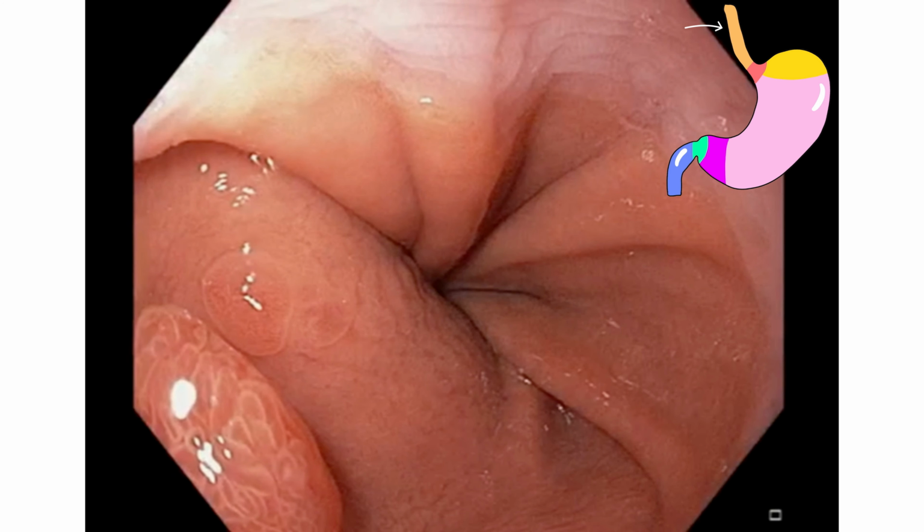This is a shorter form of an upper endoscopy. Usually it takes around 5 to 10 minutes depending on what we find. So as you can see, using this technique, we can easily diagnose conditions like gastritis, H. pylori infection, esophagitis, gastric cancer, and so on and so forth. A core skill in medicine is knowing when to order a diagnostic procedure. So pay close attention to what I am going to explain next.